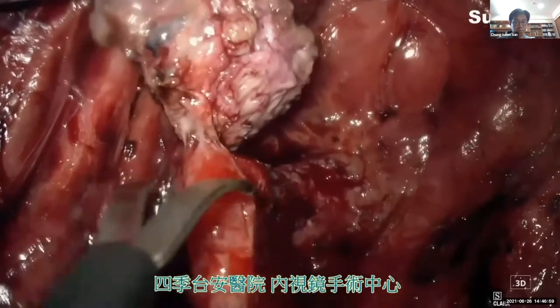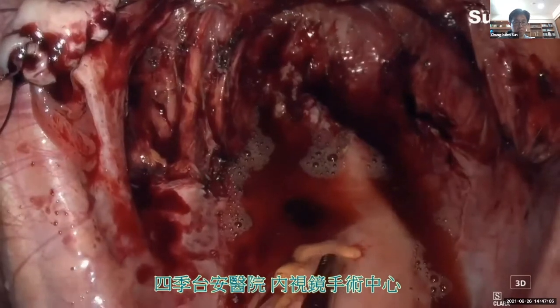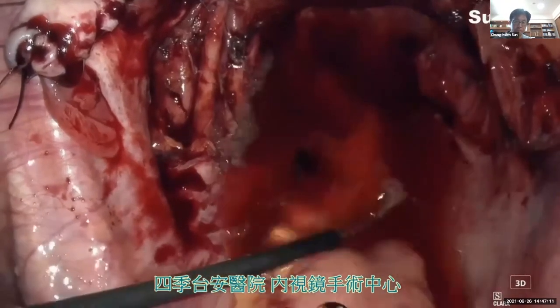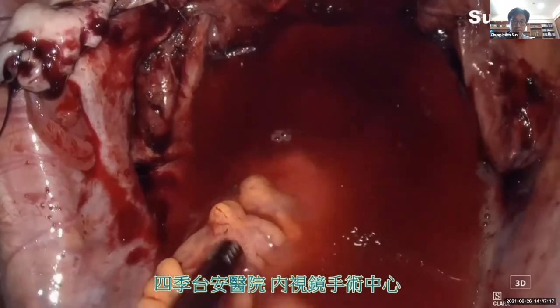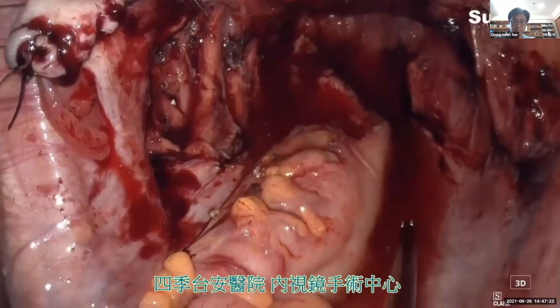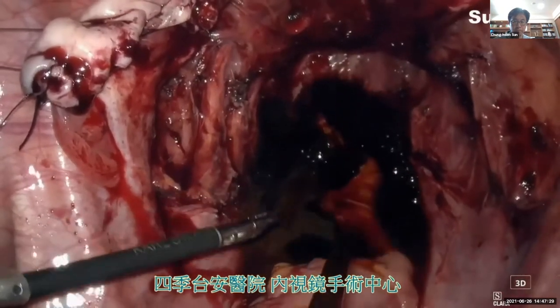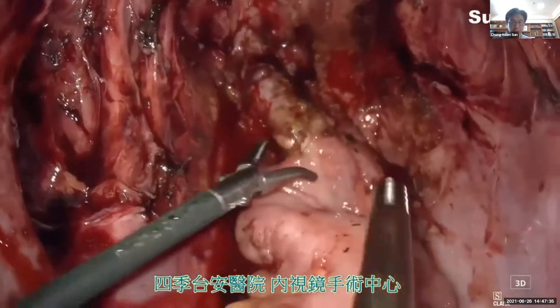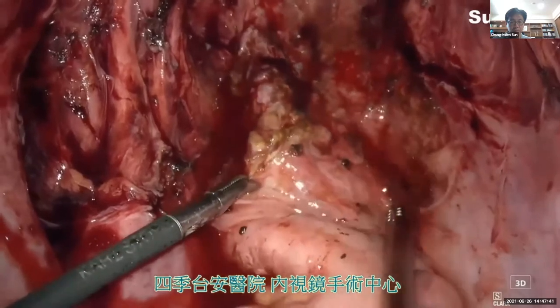Now we complete the rectal DIE shaving. We are now performing the leakage test. We put some water in the cul-de-sac and inject some air into the anus to check if there's any bubble coming out. Okay, no bubble. So we confirm that the rectal mucosa is intact. We put some iodine inside to make further disinfection. And now we are trying to identify the margin of the muscular defect.